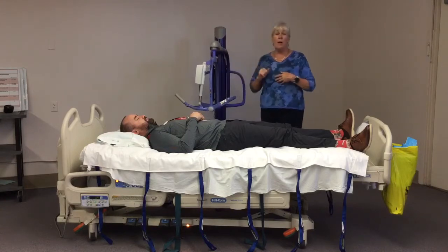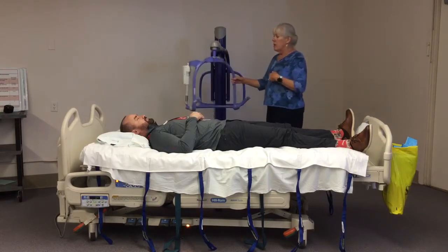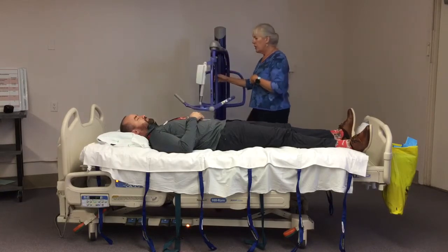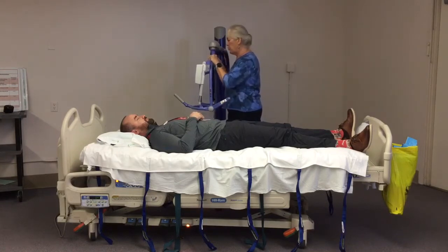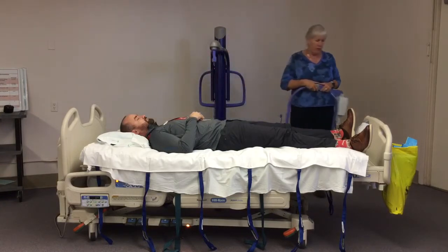I'm going to demonstrate how we change out this spreader bar from using it with the clip sling. Notice you see 2 eyes and a little smiley face. Face that to you. Come in nice and close because it's heavy. Take your thumbs, press them into the eyes and push them out. Lift up, come back and down. Keep it nice and close to yourself because it is heavy.